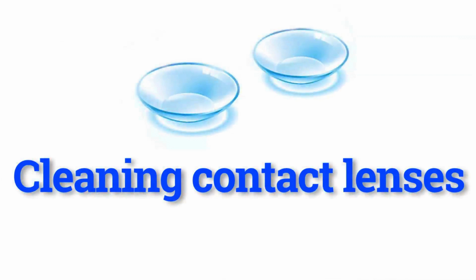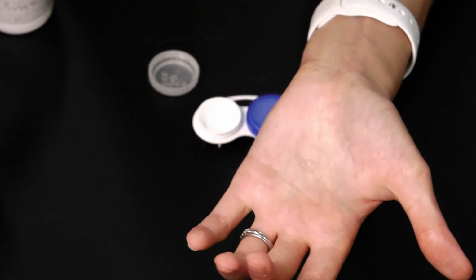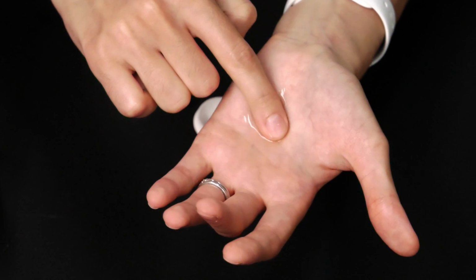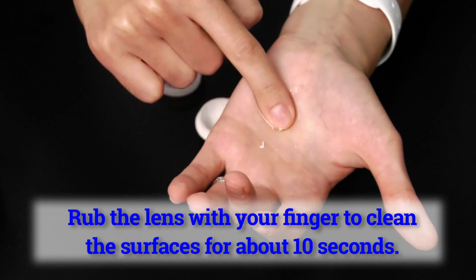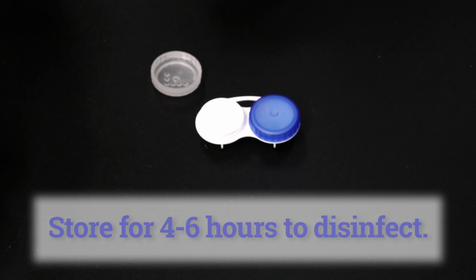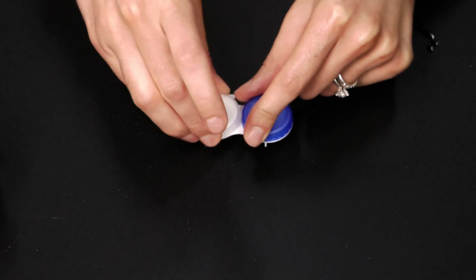The next thing I'm going to show you is how to clean and disinfect your child's contact lenses. I'll begin by showing you how to disinfect a contact lens with multipurpose solution. Place the lens in the palm of your hand and apply several drops of solution, disinfecting solution, as prescribed by your doctor. You'll need to rub the contact lens using the soft part of your finger to mechanically clean the surfaces, about 10 seconds. You'll then place the contact lens into your case with fresh solution and store it for at least 4 to 6 hours to disinfect.